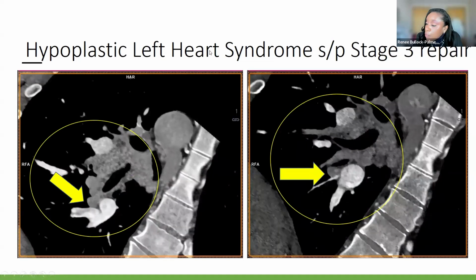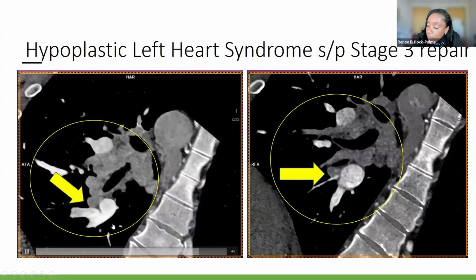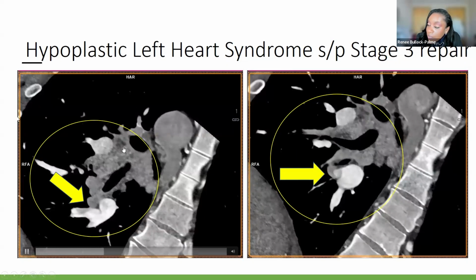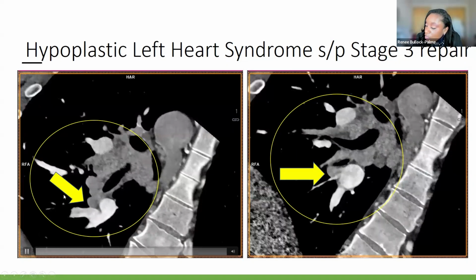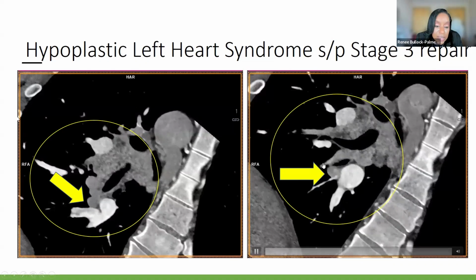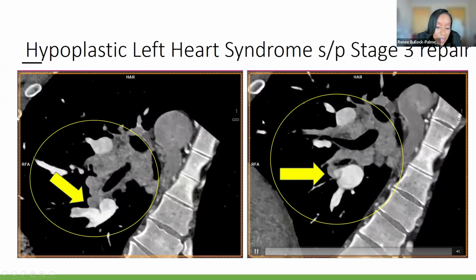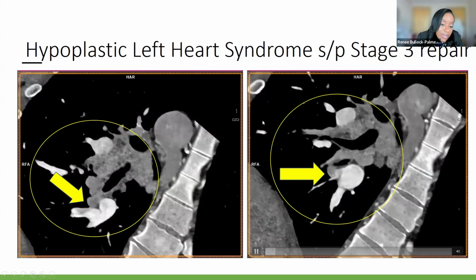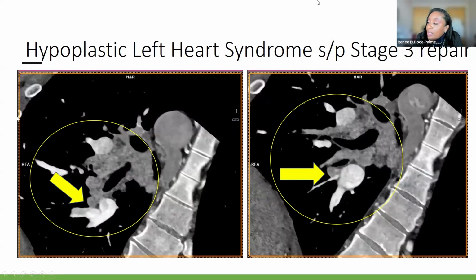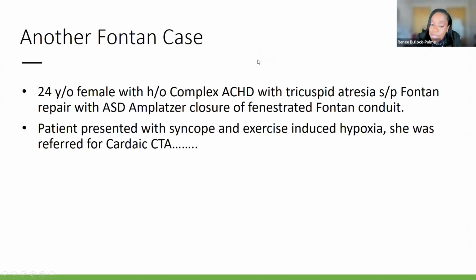And more importantly, what was causing the cyanosis for this patient was actually admixing of right to left blood, where you're seeing a conglomerate of venous collaterals from the right side, and there's actually communication with the pulmonary vein with flow causing cyanosis. So these actually had to be coiled. You know, we most oftentimes can't coil all of them feasibly in one setting, but we coil as many as we can. And this patient actually had improvement in his hypoxia.